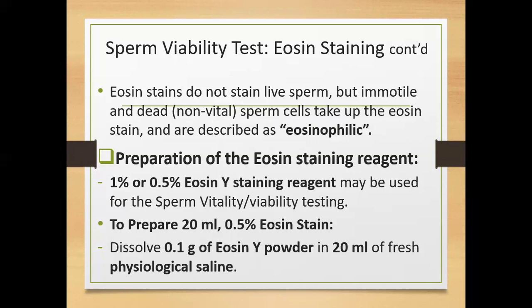You know the class 1 formula, C1V1 equals C2V2. You use that to get how much of the 20% you must take to give you your 10%. You do that calculation and you are there. The same way, if you have 1% eosin, that becomes your stock, and if you need 0.5%, you know how much of it to take to dilute to get your 0.5.